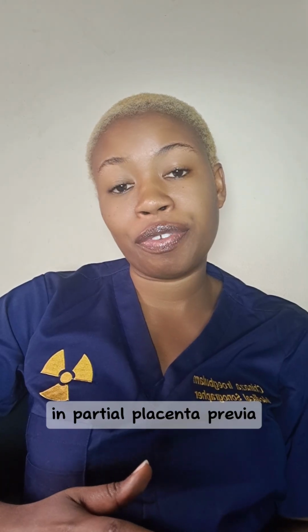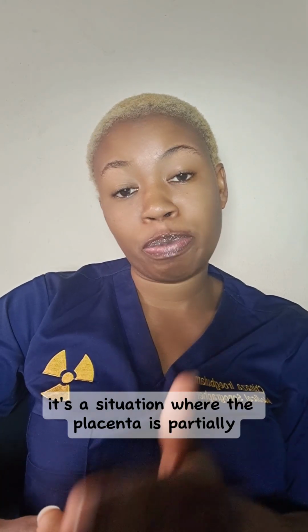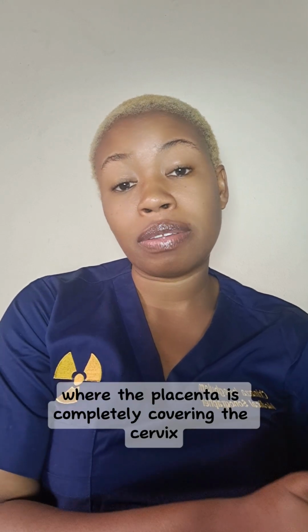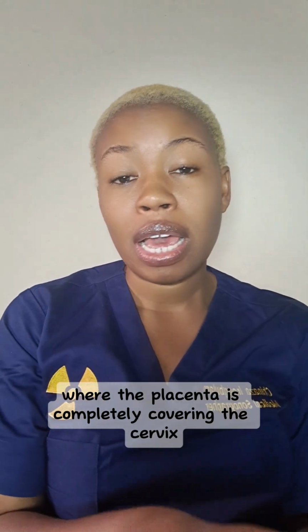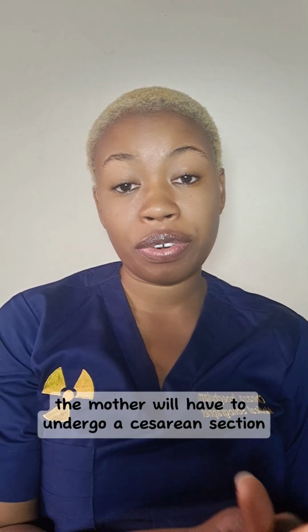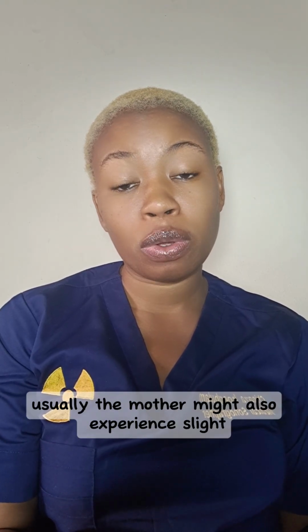In partial placenta previa, it's a situation where the placenta is partially covering the cervix, and in complete previa, it's a situation where the placenta is completely covering the cervix. In complete placenta previa, the mother will have to undergo a cesarean section. Usually, the mother might also experience slight or painless bleeding.